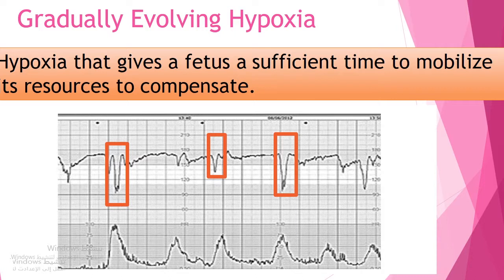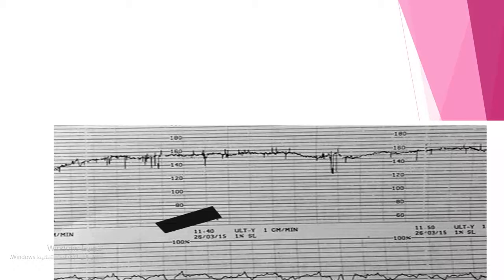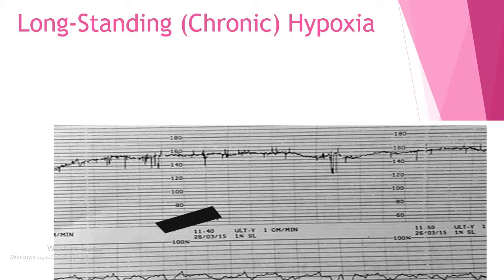If this compensation fails, the onset of decompensation sets in, resulting in a decrease in perfusion to the fetal brain. This will be seen on the CTG trace as a loss of baseline fetal heart rate variability. If no remedial action is taken, the myocardium will suffer a reduction in oxygenation with consequent acidosis that will be shown in the CTG trace as instability of the fetal heart rate baseline, culminating in a step-ladder pattern to death in terminal bradycardia.